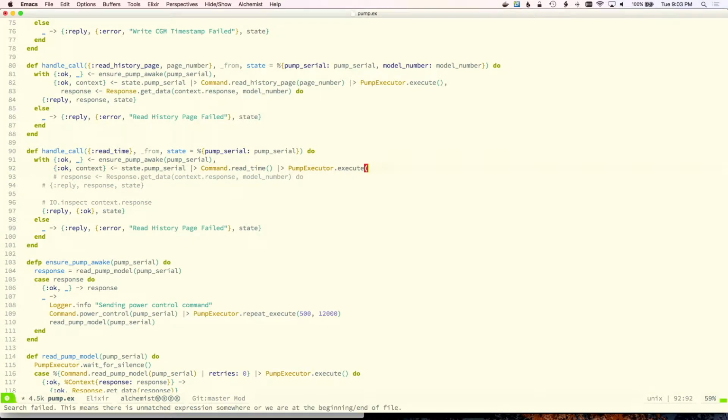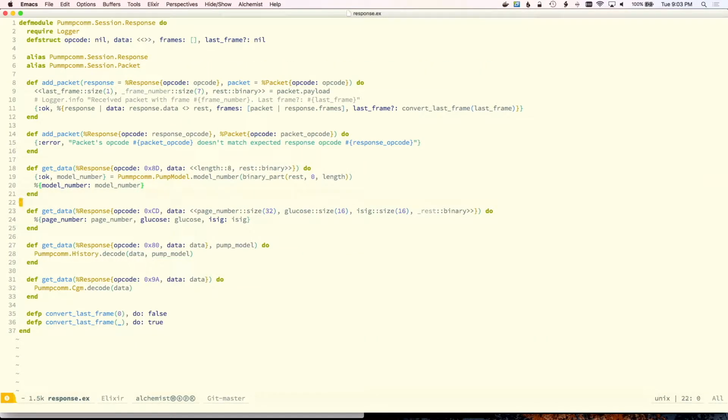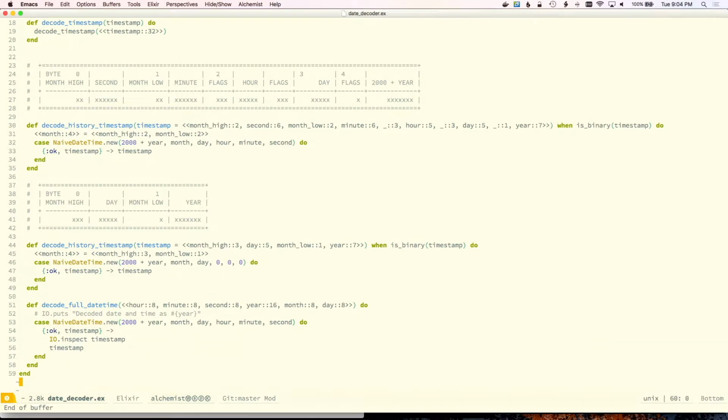In the code I have a means by which I can take the response from a command and do something with it, and that's in the response portion of this. So the command assembles the command to be sent to the pump. The response parses the response after it comes back. I'm really unhappy about how both of these things are just getting overwhelmed with repetitive junk, but I'm also of the opinion that I want to forge ahead and make progress on this. So that's a competing tension that happens a lot during the day for me too. It's hard for me to determine exactly the right time to do refactoring. I think I've put this one off maybe a little bit too long, but I'm still okay with that for the moment. And so what I'm going to do here is call this date decoder method.